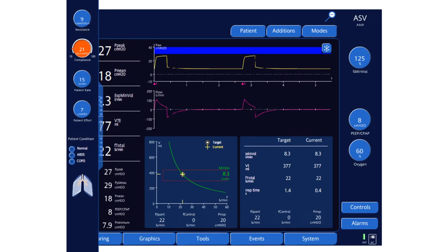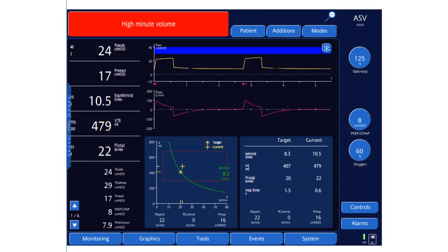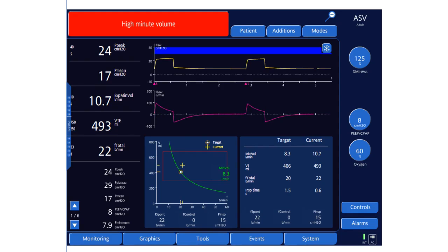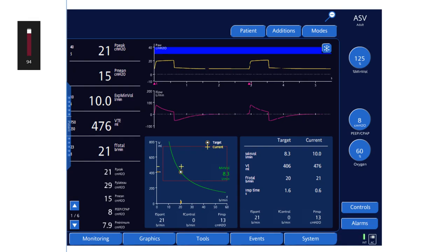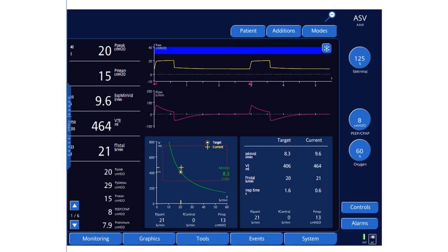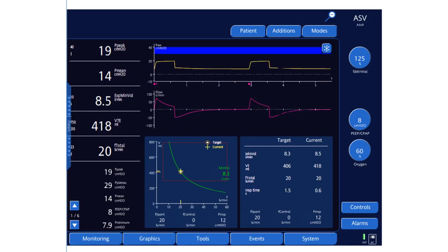Now if compliance improves, let's set compliance to 26. The same pressure will now deliver a higher tidal volume — you can see the tidal volume is much higher than the target. The pressure starts decreasing gradually. The tidal volume is at 517 but the target is 406, so the pressure decreases toward 13, then 12 cmH₂O, and the minute ventilation is still above target — so the pressure will go down further to reach the target.